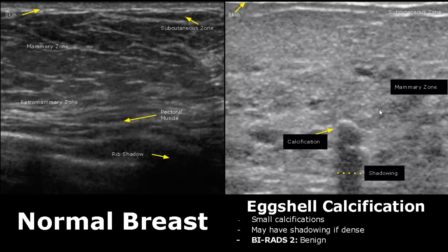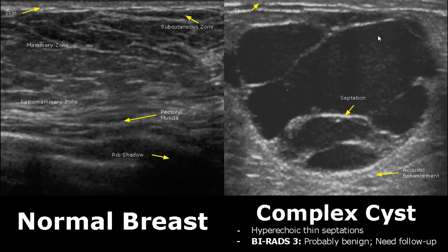Complex cysts are rated as BI-RADS 3 because they need a follow-up exam. Usually thin hyperechoic septations are benign, but they still need a follow-up, which is why they are rated as BI-RADS 3.